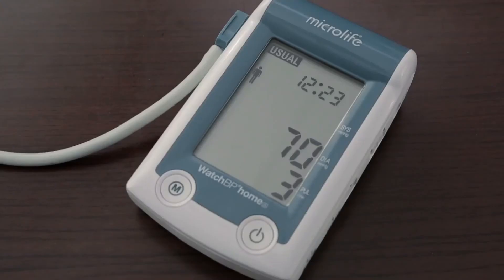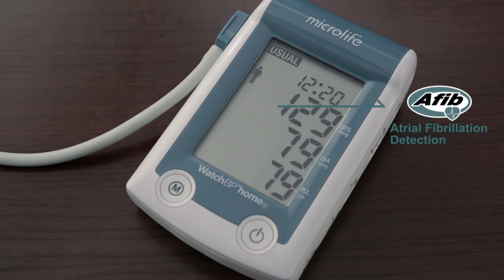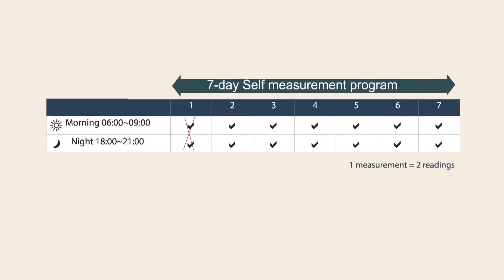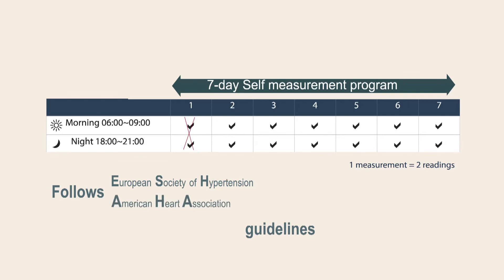Watch BP Home A screens for atrial fibrillation during blood pressure measurement. The AFib icon will flash when the device detects AFib. MicroLife Watch BP Home A also has an embedded seven-day self-measurement program that strictly follows European Society of Hypertension, American Heart Association, and British Hypertension Society guidelines.